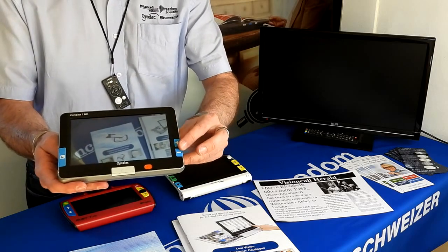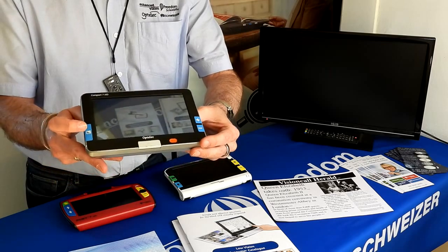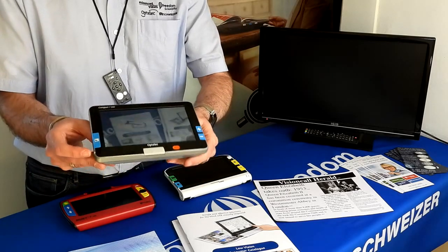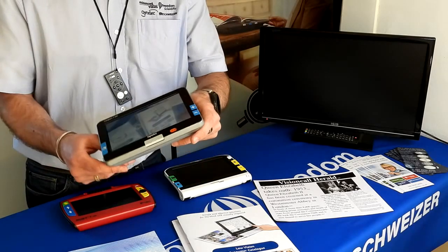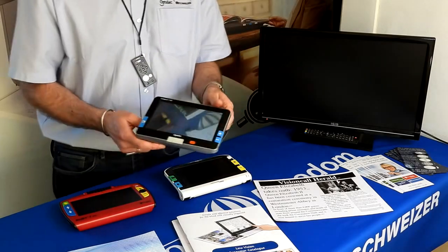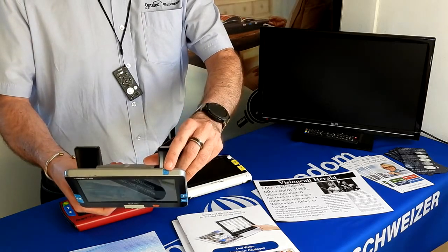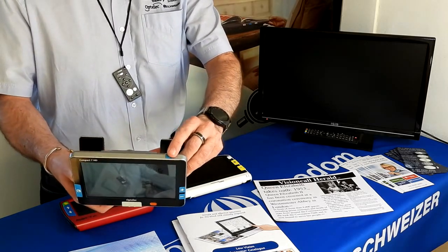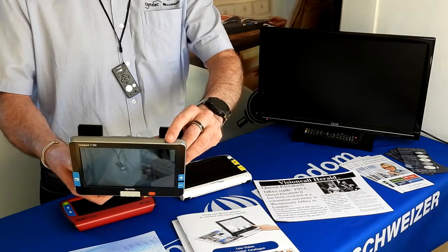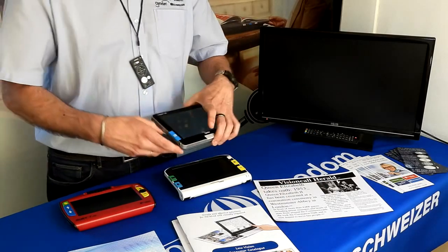The Compact 7 goes up to 24 times magnification. On the other side of the device you have contrast control, which goes from natural color through various contrasts: black on white, white on black, yellow on black, blue on yellow, yellow on blue, and more. It has a camera button on top for the option to freeze, take snapshots, and store images on the machine. There are also built-in LEDs for added illumination.